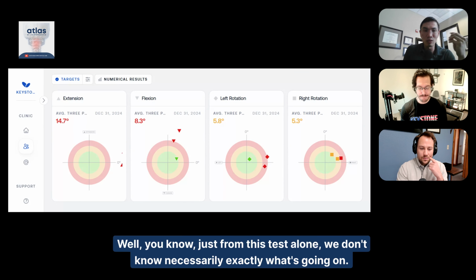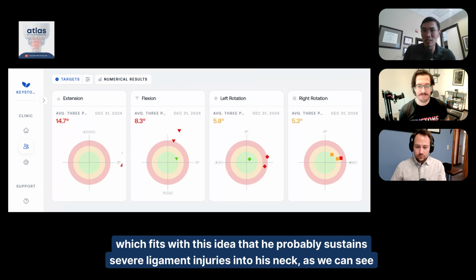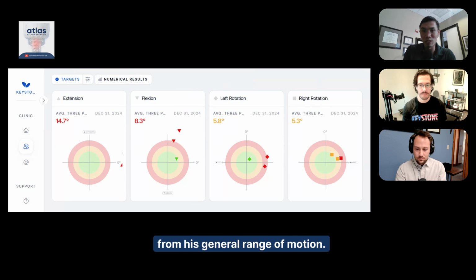So what does it tell us? Well, just from this test alone, we don't know necessarily exactly what's going on. We just know that he has a very poor ability to detect where the center of his head is in space, which fits with this idea that he probably sustained severe ligament injuries in his neck, as we could see from his general range of motion.